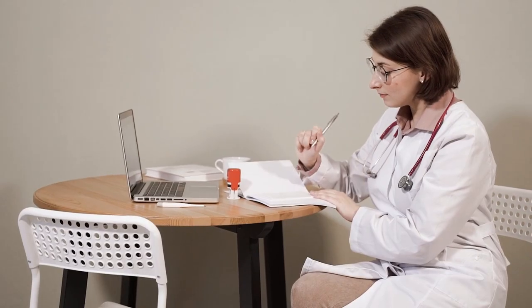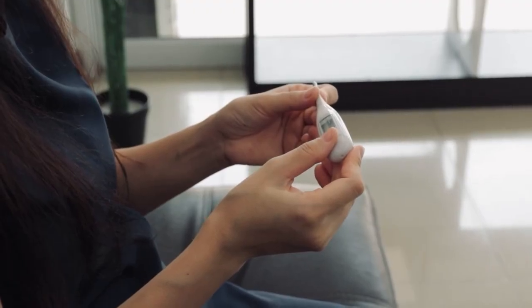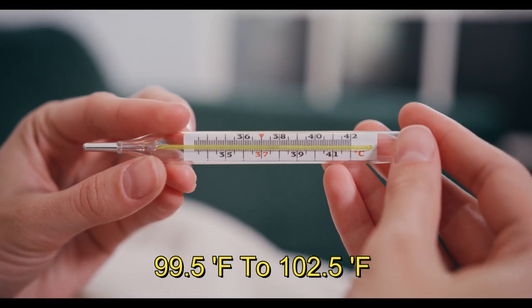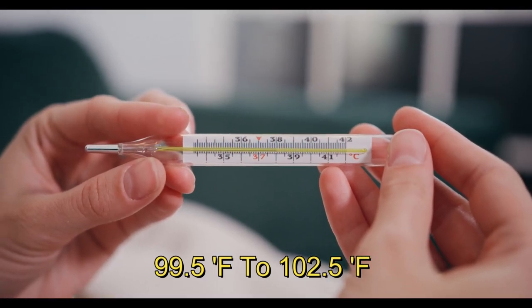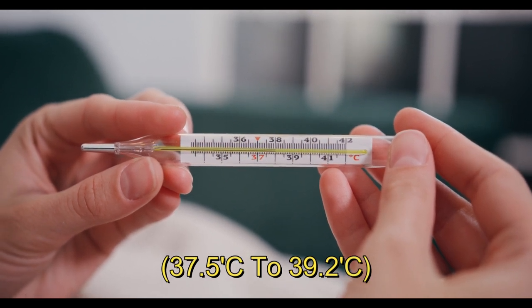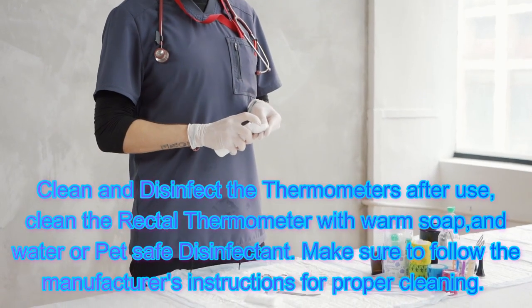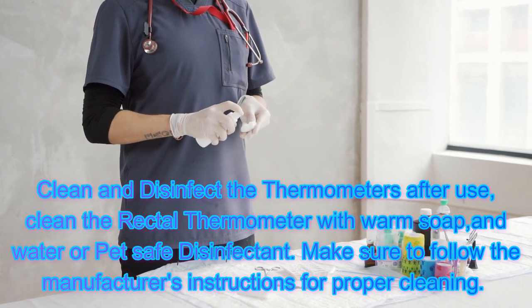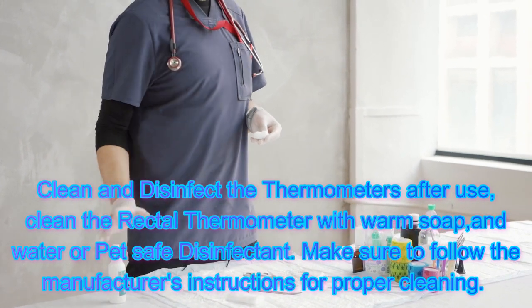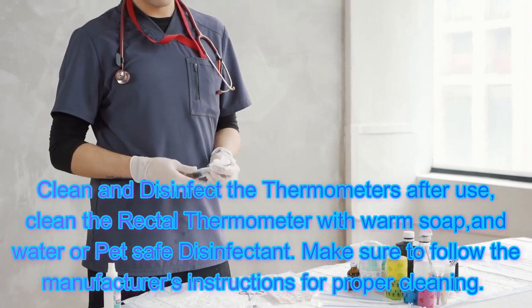Record the temperature. Once you have obtained the reading, carefully remove the thermometer and check the temperature. Normal range for a dog's temperature is between 99.5 degrees Fahrenheit to 102.5 degrees Fahrenheit, or 37.5 degrees Celsius to 39.2 degrees Celsius. Clean and disinfect the thermometer. After use, clean the rectal thermometer with warm soap and water or a pet-safe disinfectant. Make sure to follow the manufacturer's instructions for proper cleaning.